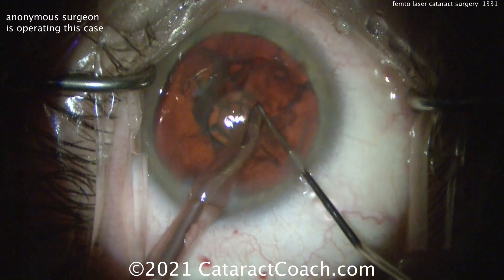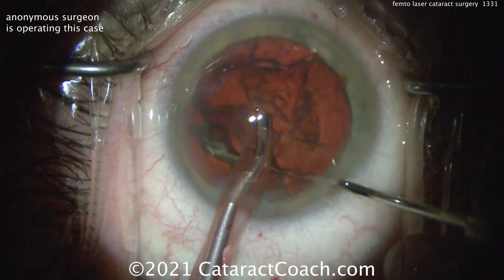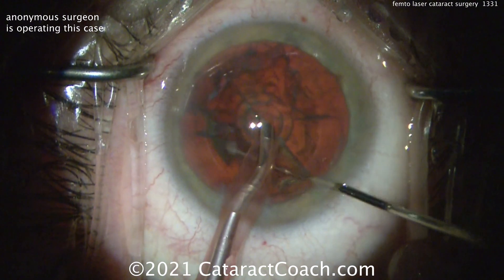So you can see the pieces are not fully separated here. The surgeon's taking out a couple of pieces of the pie so far and then rotating the nucleus around a little bit more.